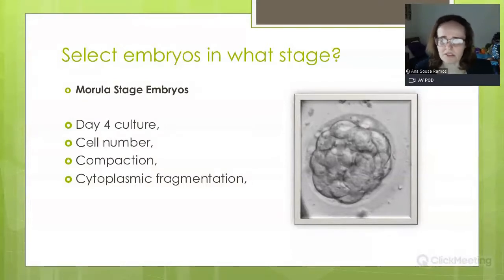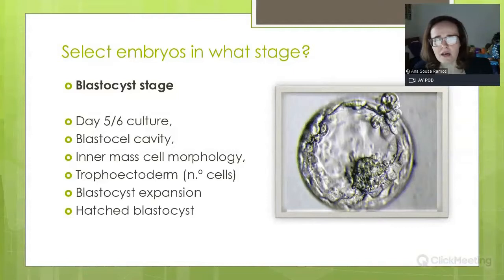The morula. I like this selection at this stage very much, but it's more difficult. And of course, nowadays the most common is the blastocyst stage, which is usually on 5-day or 6-day culture.